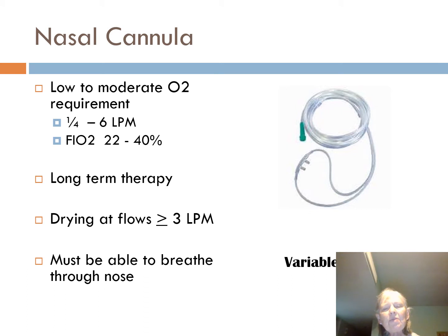What happens with these is that when you run into some of your patients, you're going to see that they've put their napkin or box of Kleenexes or something over their ears. And the reason is that these will start to pull down on their ears, and sometimes it'll break the skin and they'll have a wound up there. When you come into the lab next Thursday, I'll show you what you can put on there to prevent that from happening, or at least help the patient while they're wearing these, okay?